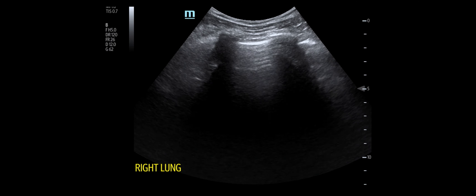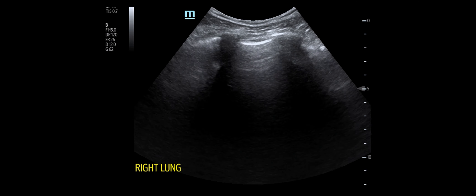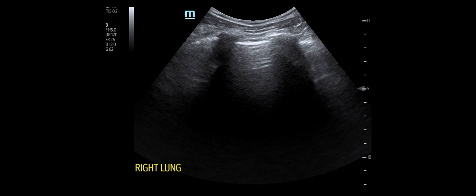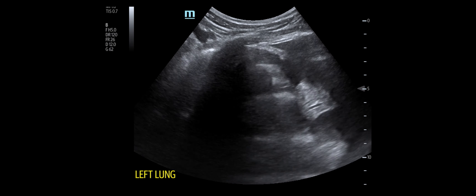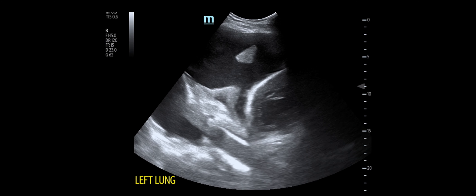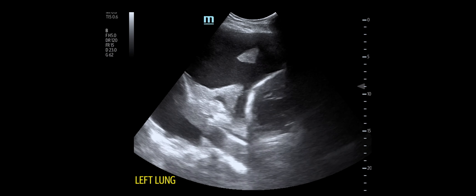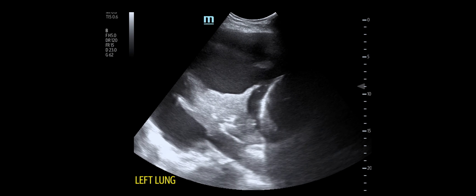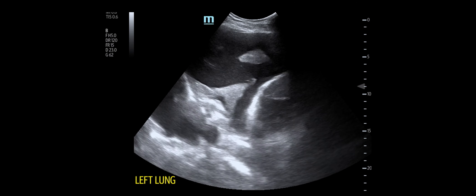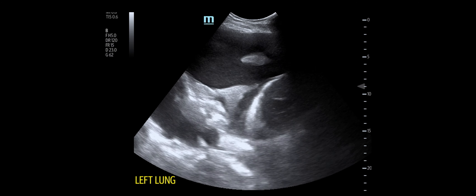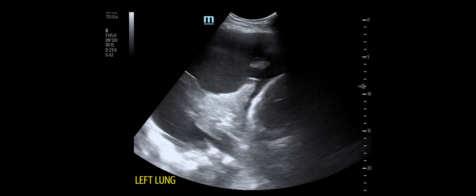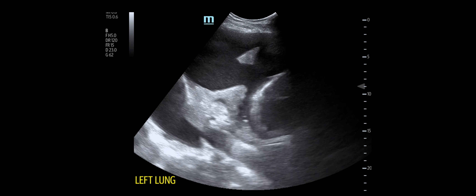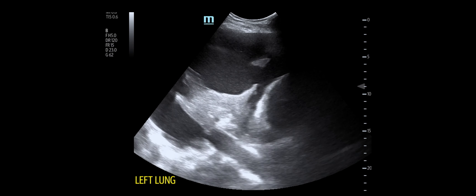Case one is an alcoholic presenting after a fall down a flight of stairs, and you perform a trauma examination. Hopefully it's clear — on the left this is an atelectatic left lung that's floating around in fluid in the left chest.